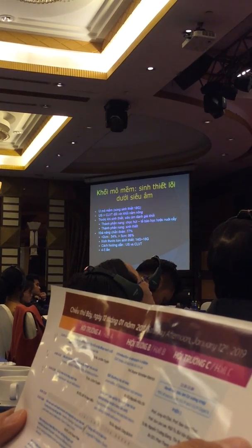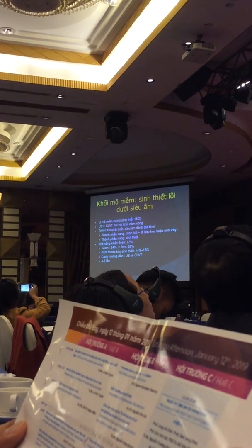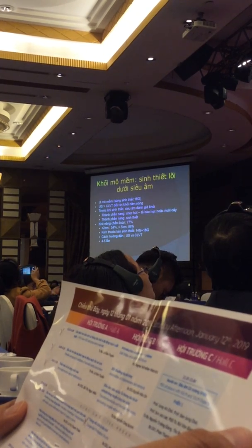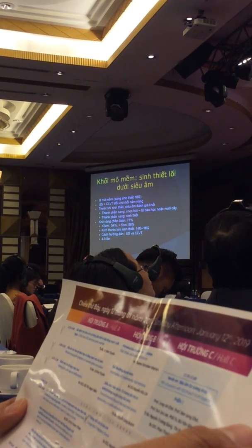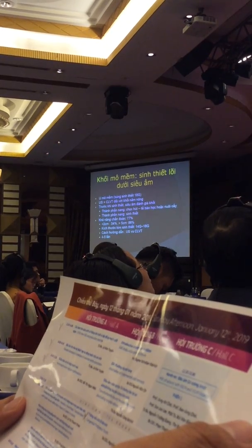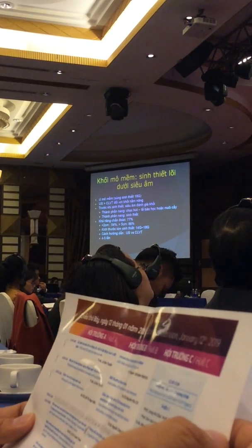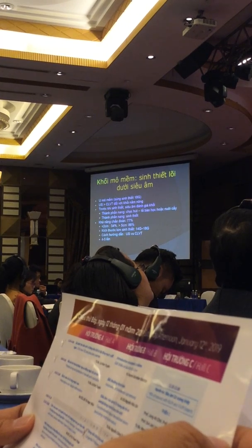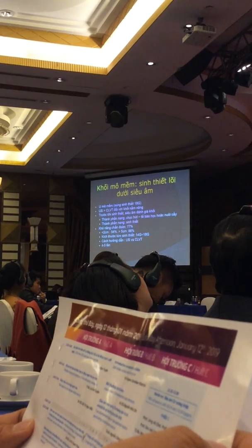So for soft tissue mass, you can do ultrasound-guided core biopsies, usually using 18 gauge gun biopsy, sometimes 16 gauge. So, ultrasound-guided biopsy is very good for superficial masses. You can easily do this. Prior to biopsy, you should evaluate and target the solid portion for biopsy. For the cystic portion, it's better to aspirate. And you can also do cytology or culture from the cystic portions.